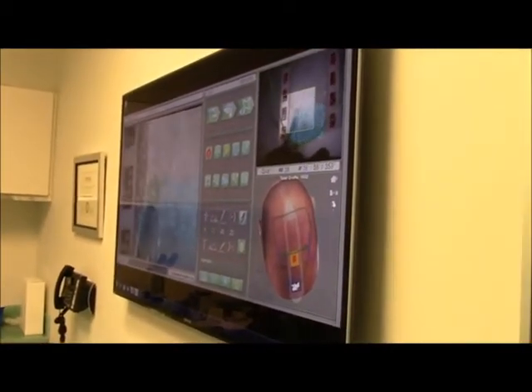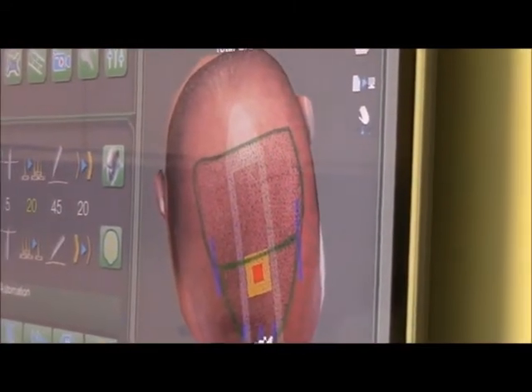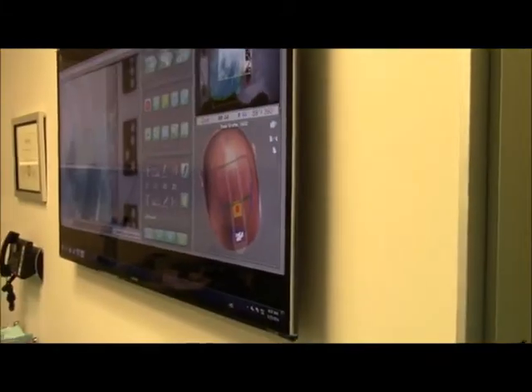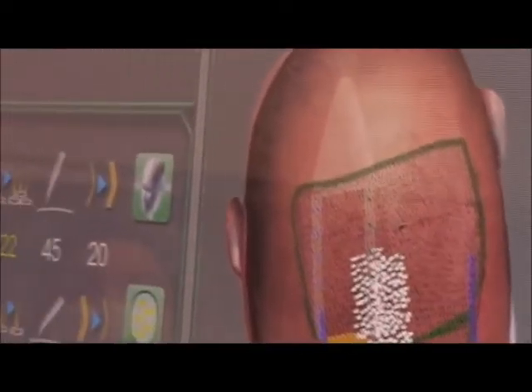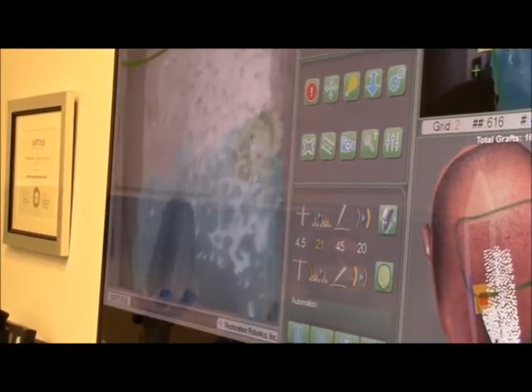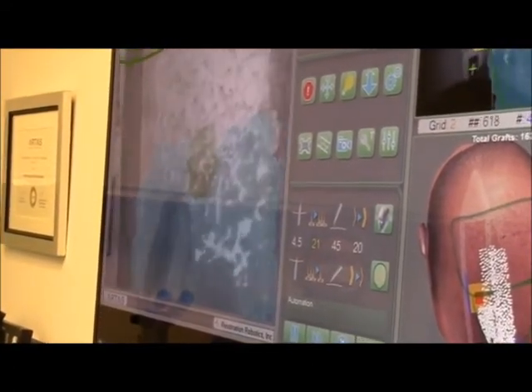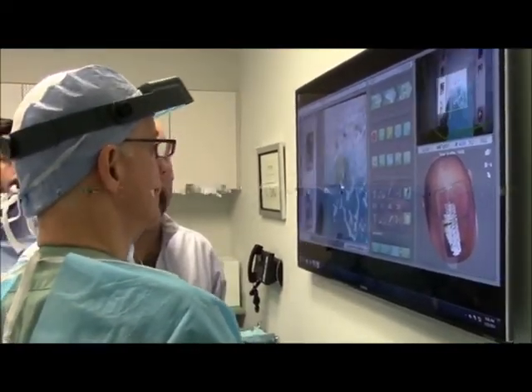And this again is just a projection onto the television screen. You can actually see at the bottom of those white spots where the recipient sites are being made. If you look in the central panel, this is actually the robot visualizing the scalp and identifying the hairs. In the central panel, as you can see now, these numbers — 45 and 20 — are parameters that determine the density, the angle away from the scalp, and the distribution of recipient sites. So all the parameters had already been programmed into the robot before it started to make the sites.